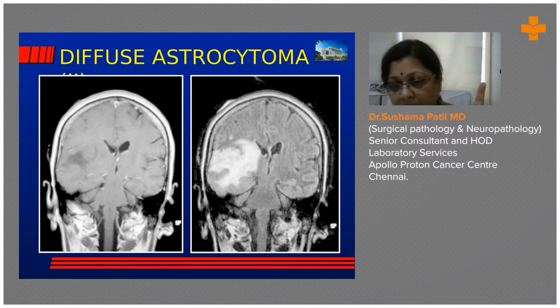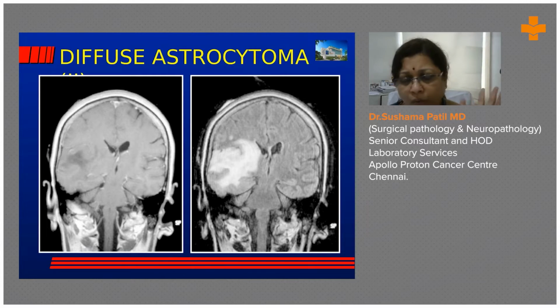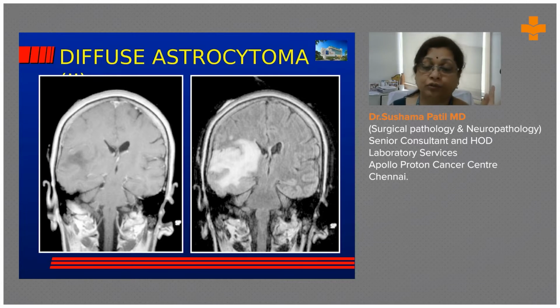You should remember, when the tumors are low grades, they respect the anatomic boundaries. They just go along the nerve bundles, they infiltrate, but they don't destroy. The overall structure of the brain is maintained intact. Okay, so that is why many a times we find it difficult when they go to biopsy. You may not see the tumor or the tumor area very atypical from the normal brain. That is why they search and ask us for frozen.